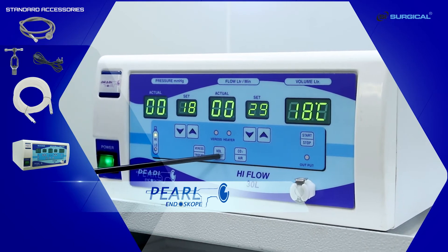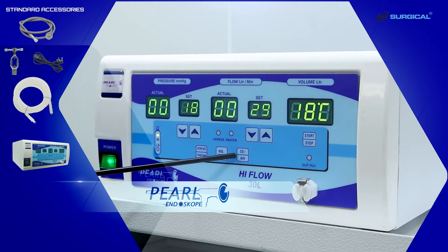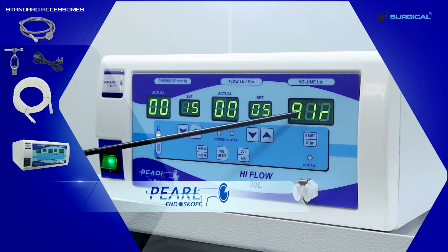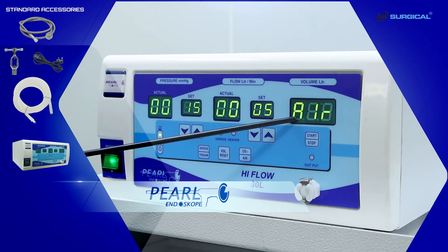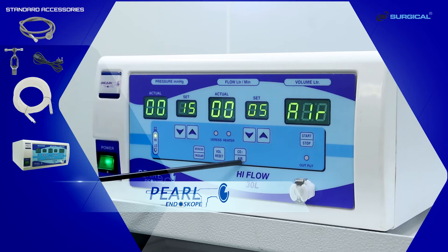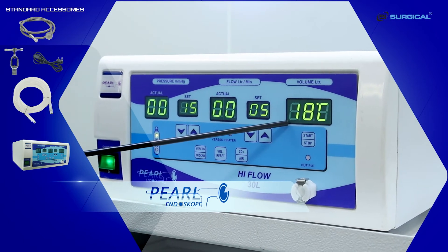This is the volume reset button. These are the CO2 and air mode. When this switch is pressed, the machine is on air mode — the display confirms the mode. On pressing the switch again, the machine goes into CO2 mode, and this display confirms it.